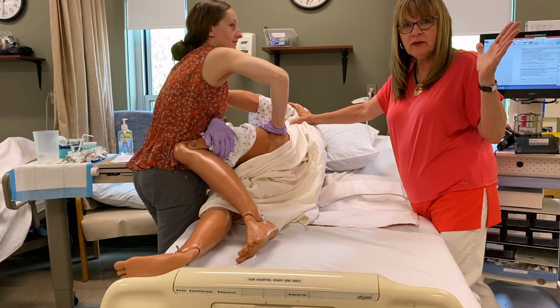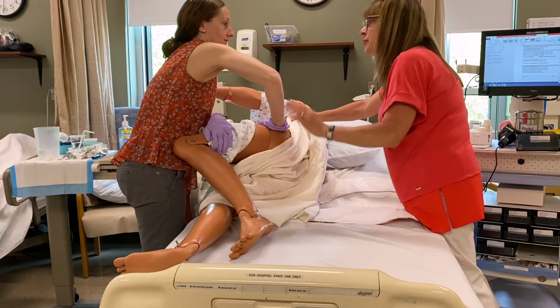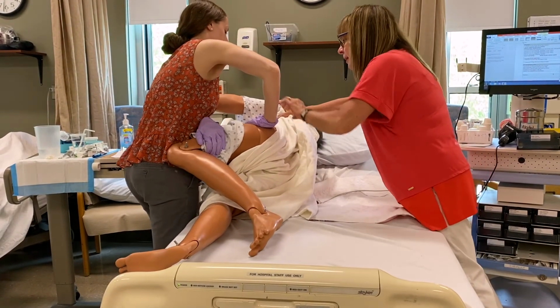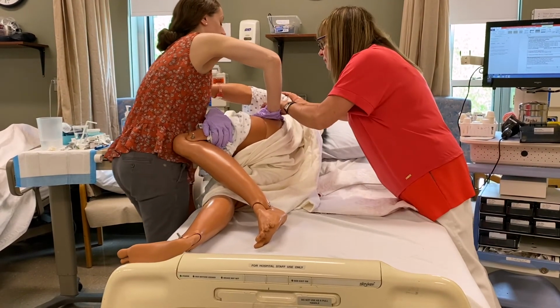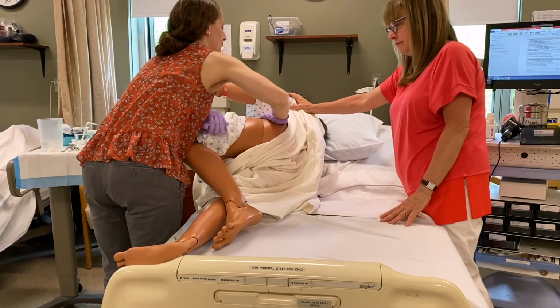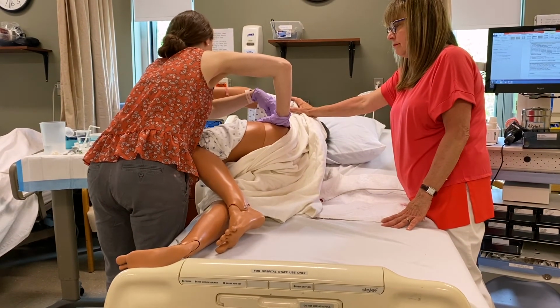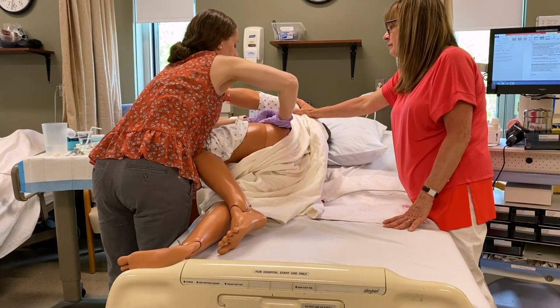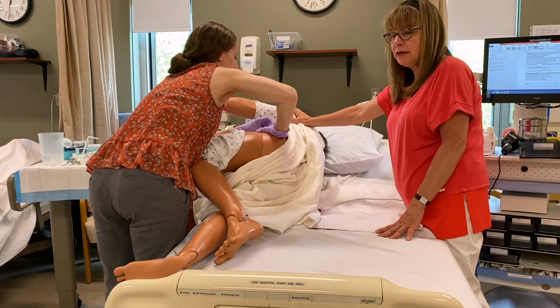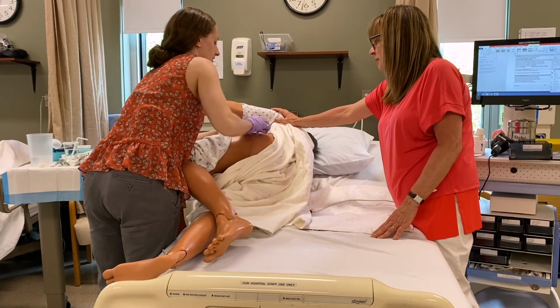Right leg, you're going to palpate with your left hand. So this is his left leg, you're using your right hand, correct? Greater trochanter. I'm going to feel for the crest, his iliac crest. Yes. Spread my fingers, and that is going to be my target right there. Correct. I'm going to mark the target with a little alcohol widget, and you can leave it there to mark your spot.